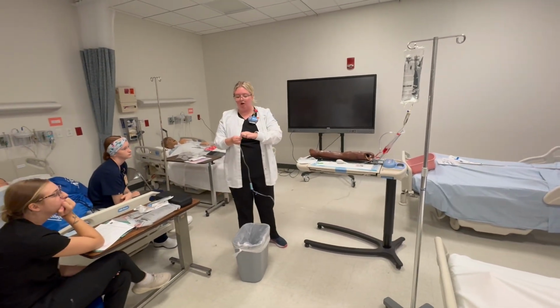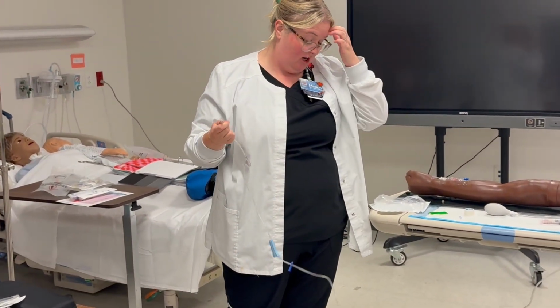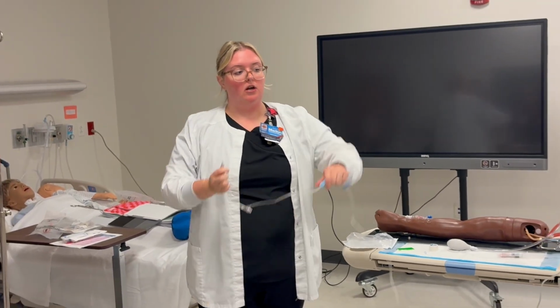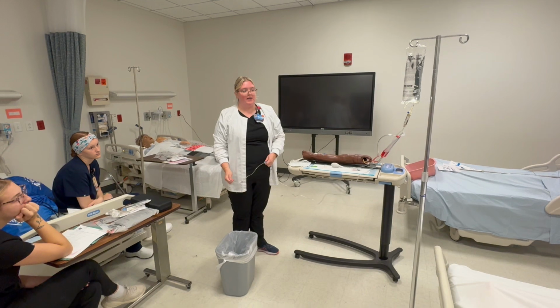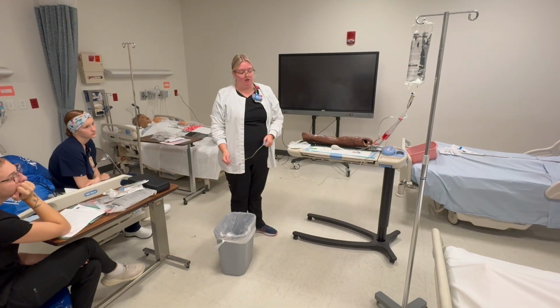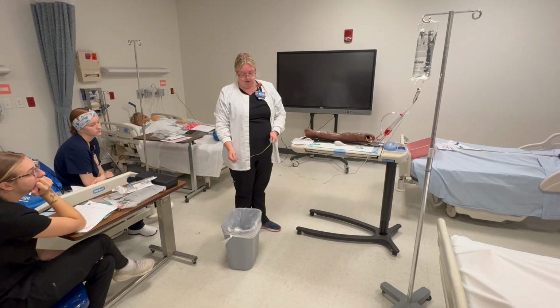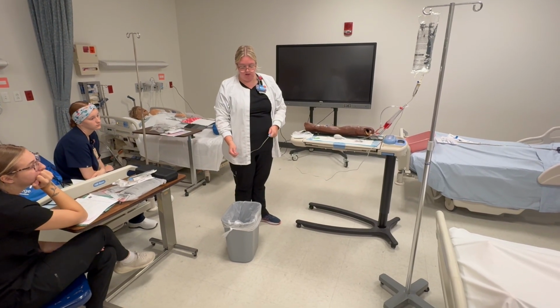Okay, cap off. Can I touch this end? No. So you want to hold this in one hand, roller clamp in the other, and you're gonna watch the fluid come down, okay? I'm gonna hold it over here so that it has somewhere to go. So see how fast that flows? That's why you wanna have your hand on the roller clamp. So we're gonna do that.